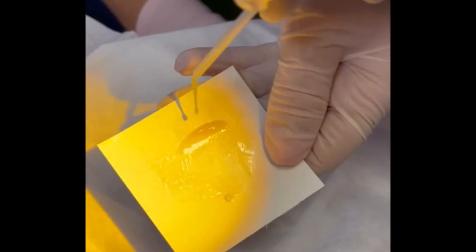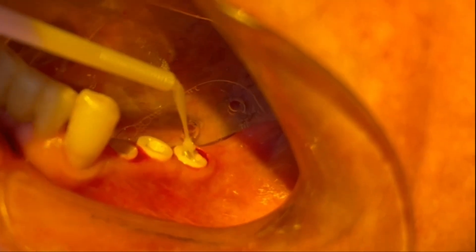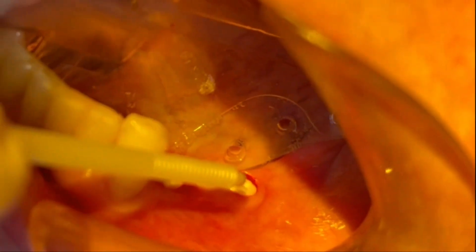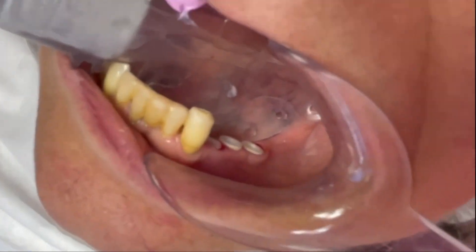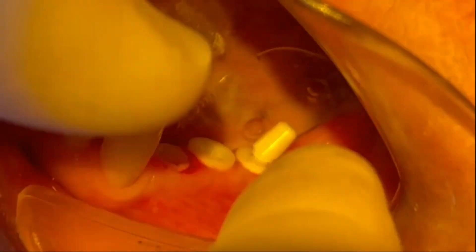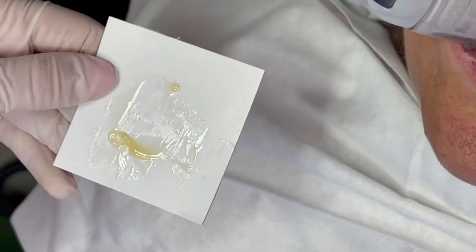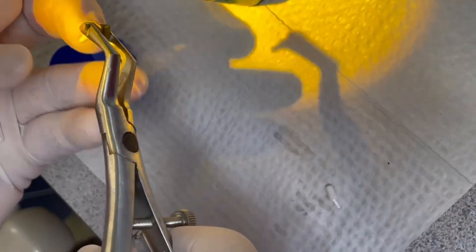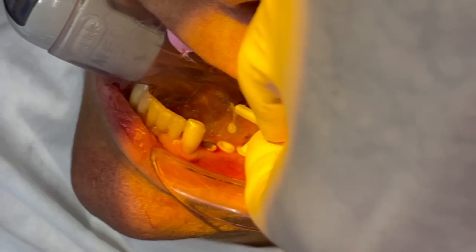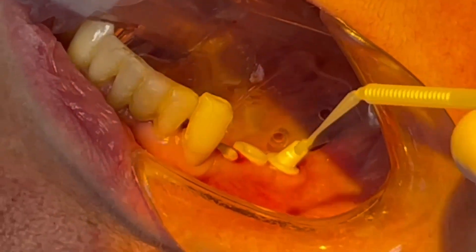We prime it with Z-Prime. And because both the abutment and implant are made of zirconia, we have to prime both surfaces. A thin layer of cement is placed only around the neck of the abutment. This is pushed in and held in place after wiping off excess cement, then cured while we hold it in place.